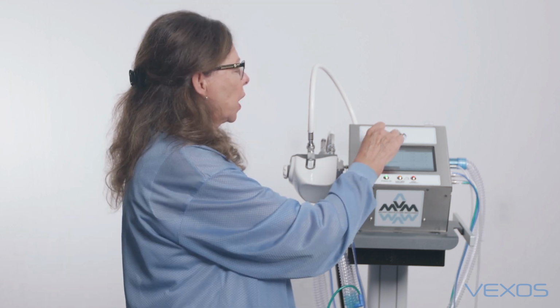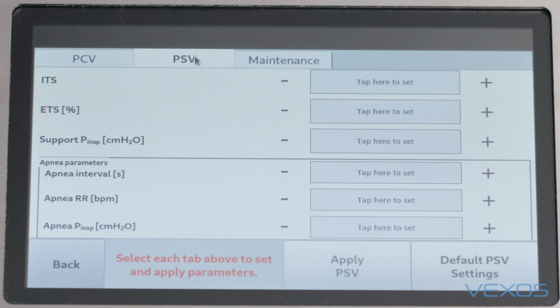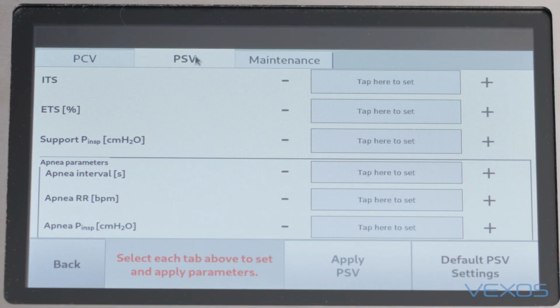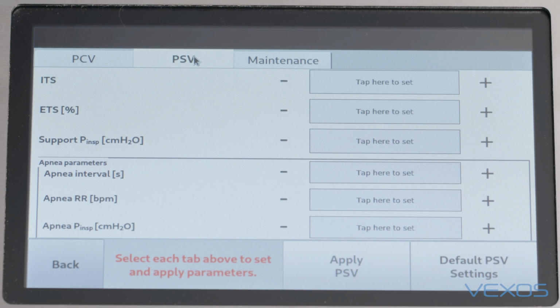I must go now and do all the settings for pressure support ventilation. The same type of menu is shown. For pressure support ventilation, there are fewer parameters to set. The first one that is shown is the inspiratory trigger sensitivity, ITS.